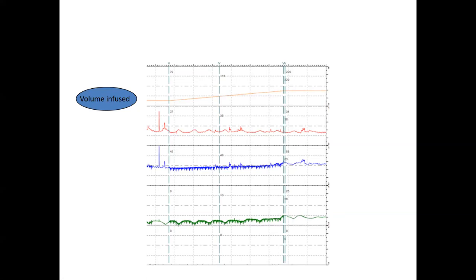They're slightly more evident if you haven't put the rectal catheter in far enough and it's sat within the muscular structure of the anal canal. If you can pass it into the rectum, they're slightly less evident, and they don't happen in everyone. There's nothing I necessarily need you to do about them, apart from please never overanalyze this as being any form of detrusor overactivity. Make sure that if you've got any concerns, you look at the lines above.